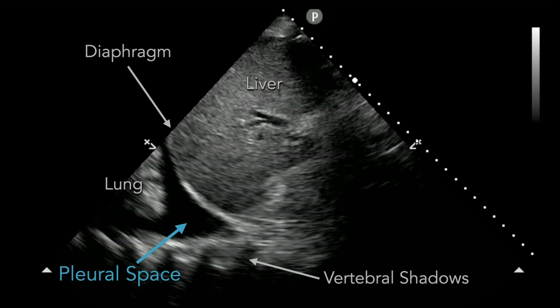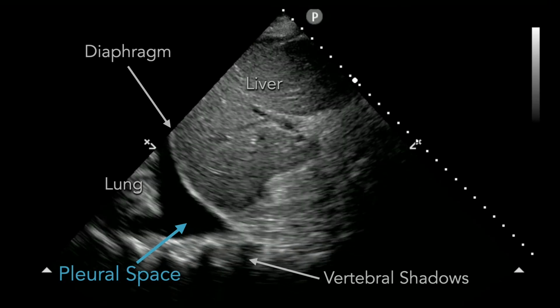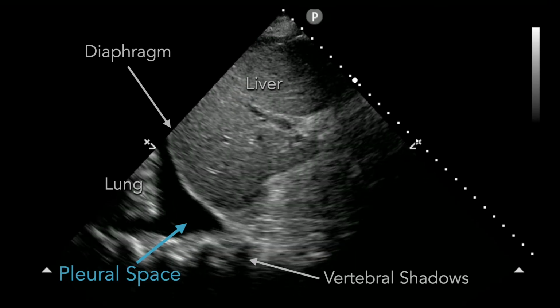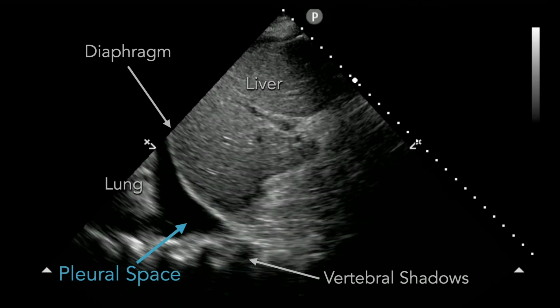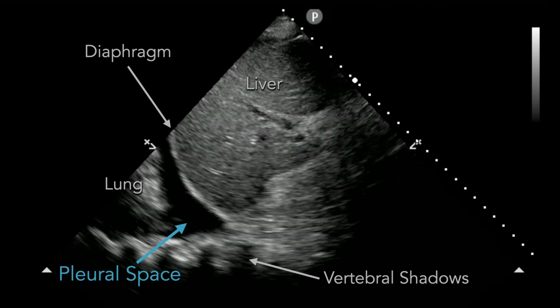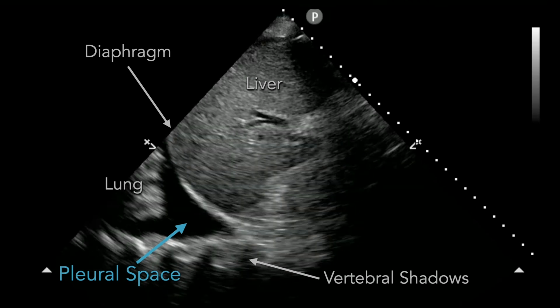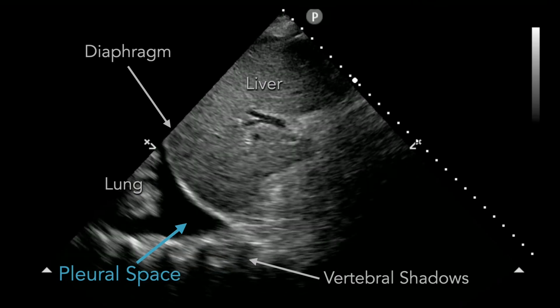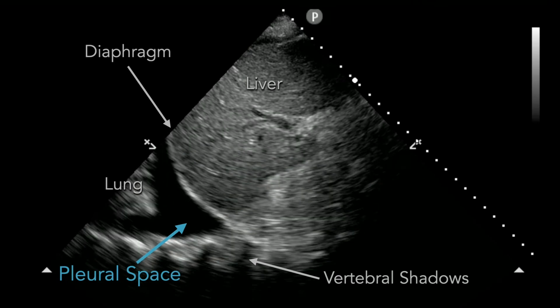And then what I'll look for is the lung above it, right? And so if you put fluid inside the thorax, it's going to crowd out the lung for space, right? There's only so much space that's inside the thorax. Generally, as we breathe, the lung will aerate, right? We get air down into the alveoli, and as we do that, that lung expands to fill the entirety of the thorax, right? But if you put fluid in there, that fluid is going to compete for the air, right? And the fluid's less compressible than air, and so it's going to stay in there, and the air-filled lung is just going to give way to the fluid, as they compete for volume.